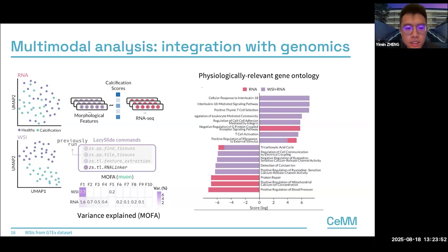And with the RNA linked to each slide, this can help you use a scoring, for example, a score we derive from text-image similarity analysis, to supervise the RNA-seq analysis. For example, here we run some pathway analysis with this kind of integration.